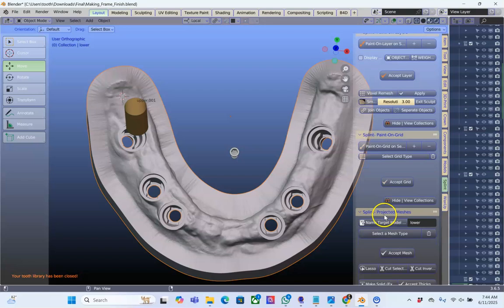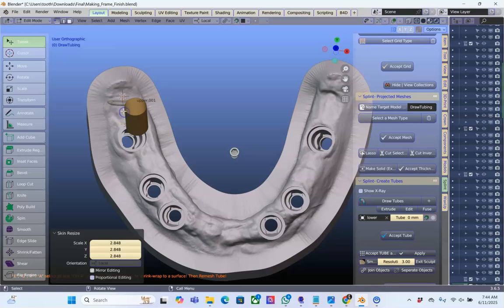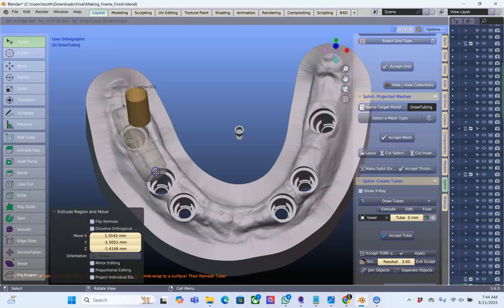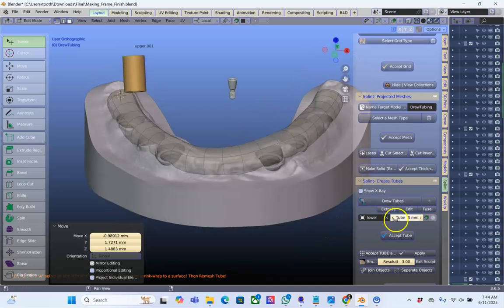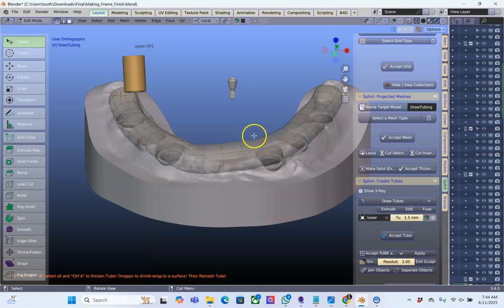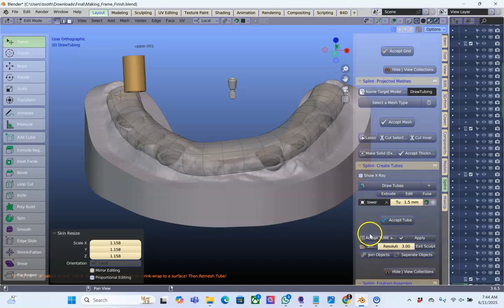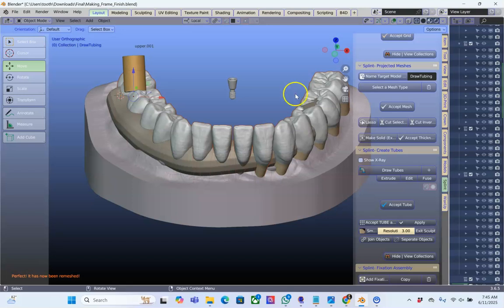I'll go to the tubes section, tube, and I'm going to shrink wrap that onto the model. Control A to make it bigger. I'm going to grab and extrude this tube all the way along. So I'm going to lift this tube up a little bit. Control A. Okay, and we're going to then commit to that, and we're going to accept the tube to voxel, remesh the tube and apply. Let's have a look and see where our tissue is.